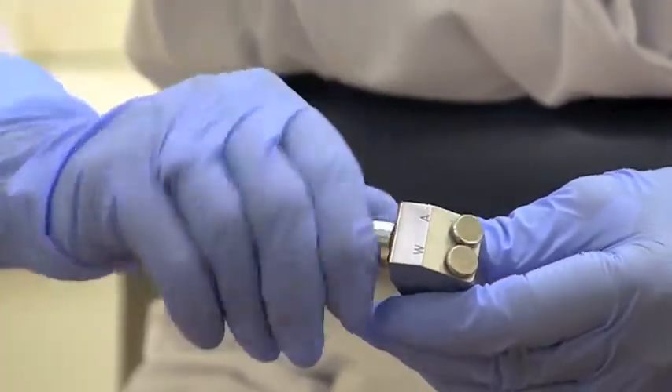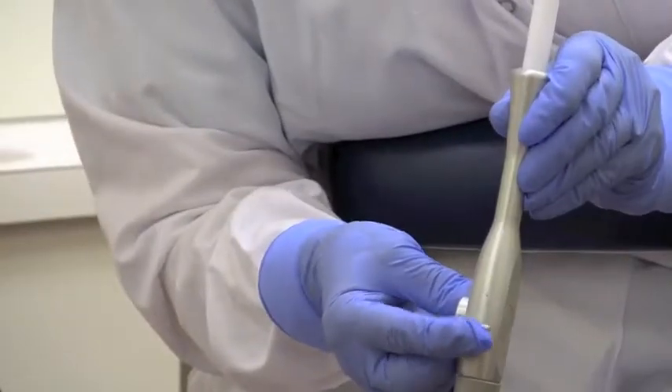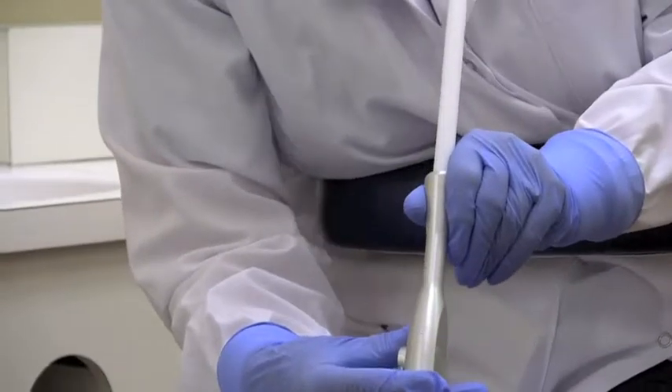To insert the air water syringe tip, loosen the metal hub and push the tip securely into position, then tighten the hub. When using the high and low volume suctions, ensure the lever is in the full open position to maximize suction strength, as indicated by the reduction in noise.